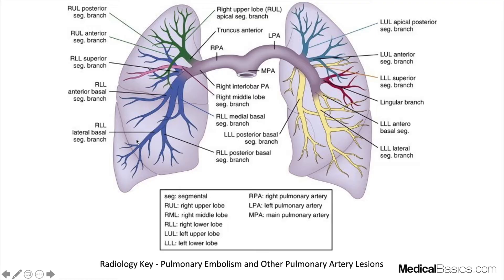On the left you'll have the upper lobe, the lingular — which is kind of the equivalent of the right middle lobe — and then the left lower lobe. When we talk about segmental versus subsegmental, you're going to have a segmental branch, and whenever that branch branches again, that's going to be your subsegmental branch.